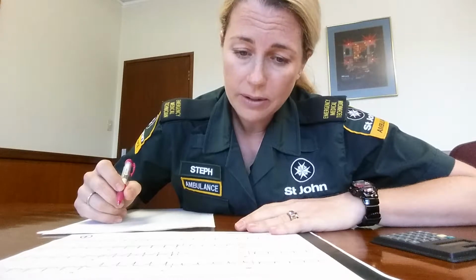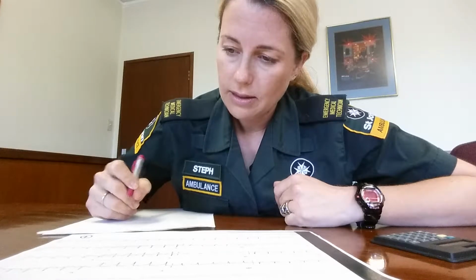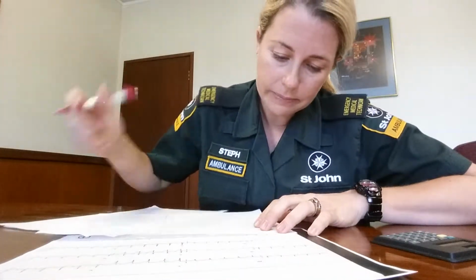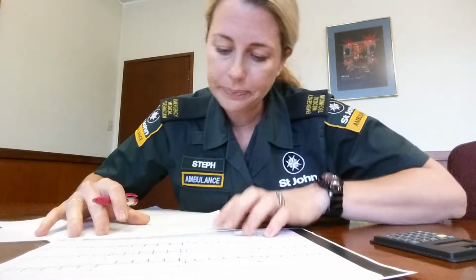There doesn't look to be much artifact. I've got a negative AVR, which tells me that the leads should be in the correct position. Right, I'll go for the rate now. Let's see if it is regular. And I've got a QRS in every lead, so that is good as well.